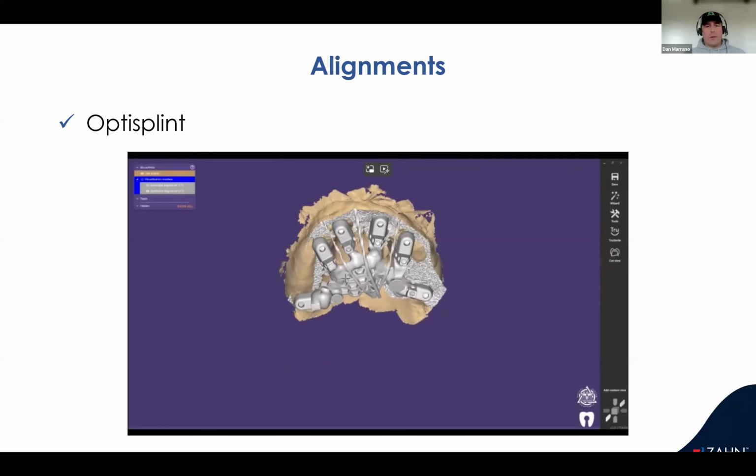I think the actual time on that video was about 2 minutes. You would have been dragging all those in through additional scans in 3Shape. And we do turnarounds in about an hour on our surgery. So I don't really want to be spending 15 minutes aligning a case. I want that done and over with and move on to my design.